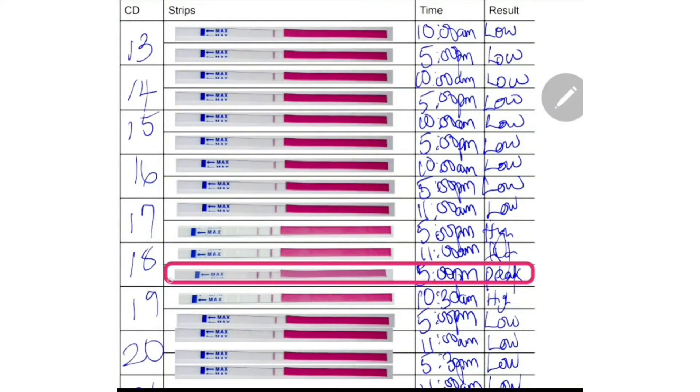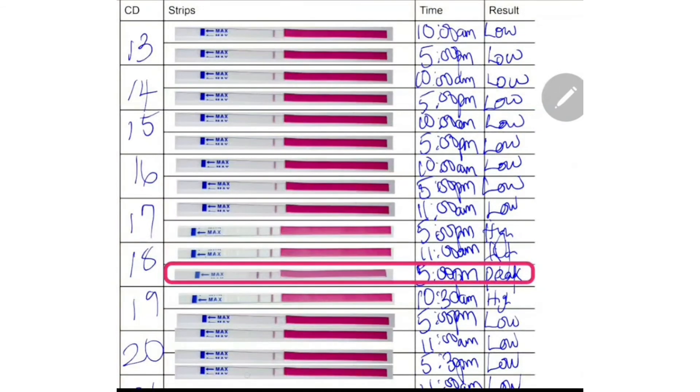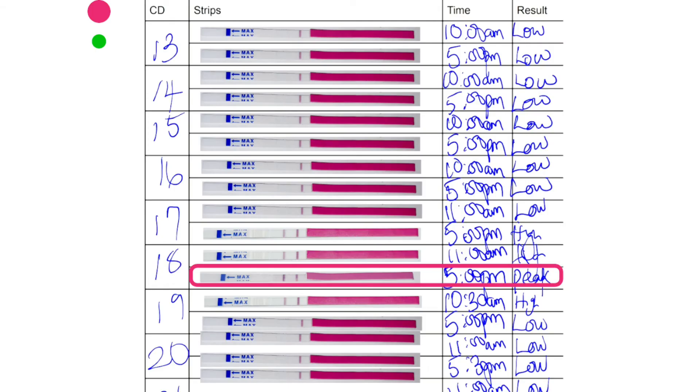And on the 18th evening, when she tested at about 5 p.m., she had a peak. You can see the test line darker than the control line, which means that she'll be ovulating in the next 24 to 36 hours. And she can take advantage of this window to do what people who want to have babies do.